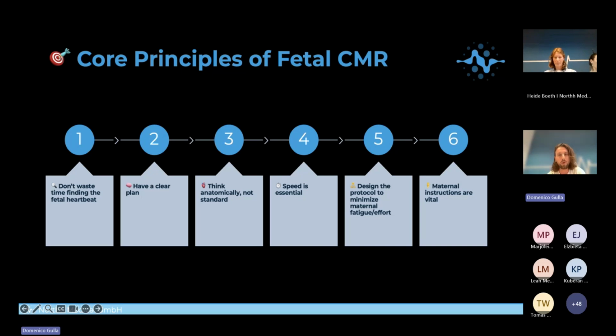The last really important thing is maternal instruction, which is vital. Before the session, it's really important to instruct the mother to hold her breath during the breath hold sequences. It's also important to communicate continuously with the mother during the acquisition to understand if the baby is moving at that moment, because sometimes we find that the sequences are full of artifacts.